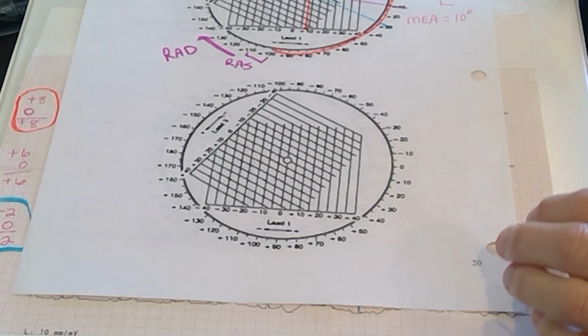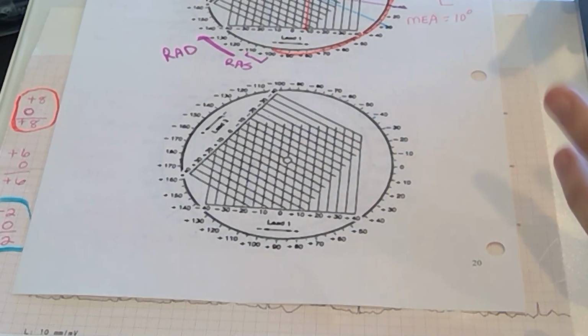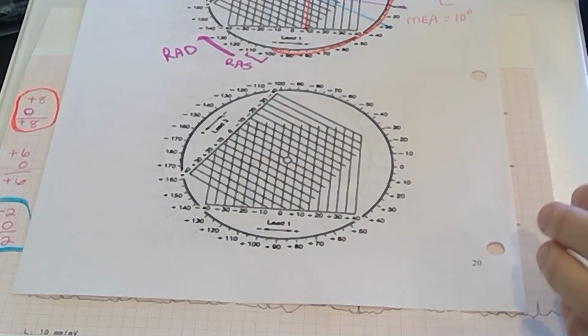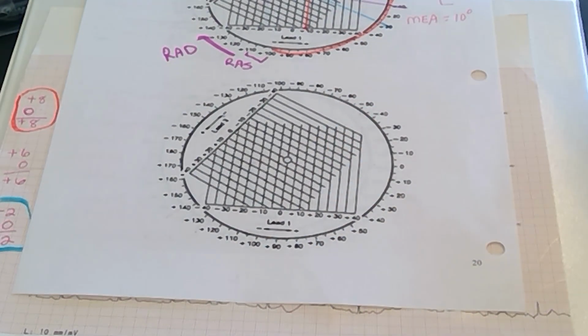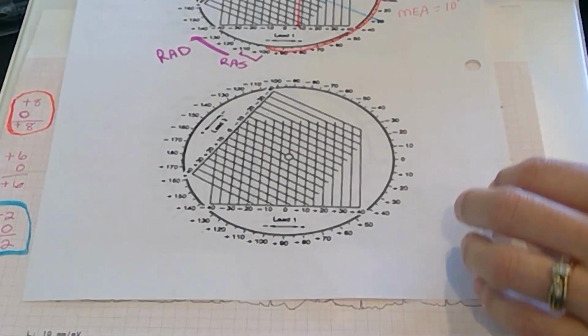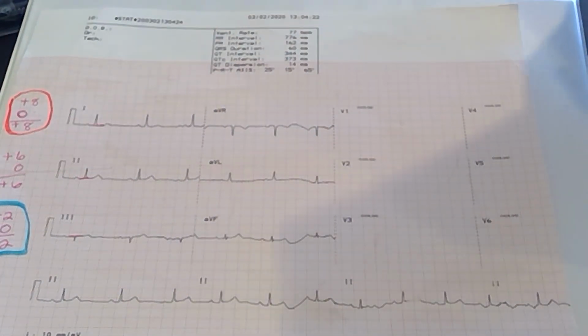So when you do the MEA for the breath in versus breath out, you're going to see for the breath in that the person's MEA compared to rest should shift to the right. And if they are exhaling, for regular breathing, it should shift to the left. So let me demonstrate that for you.